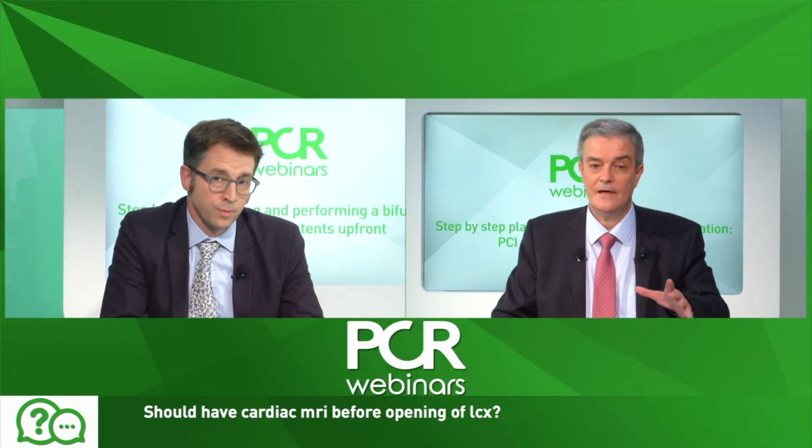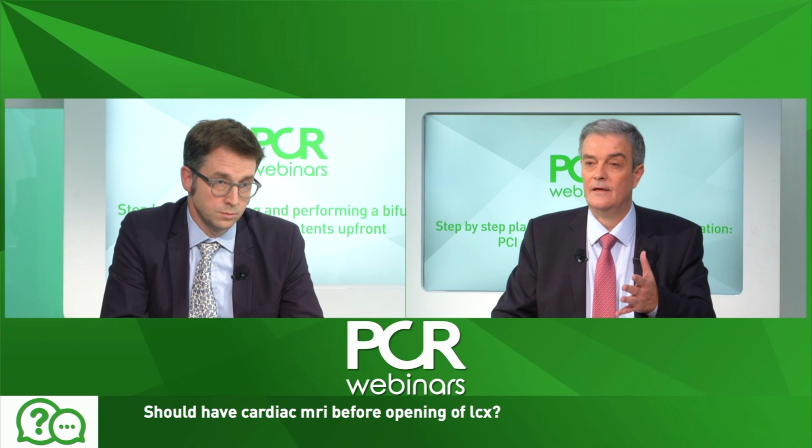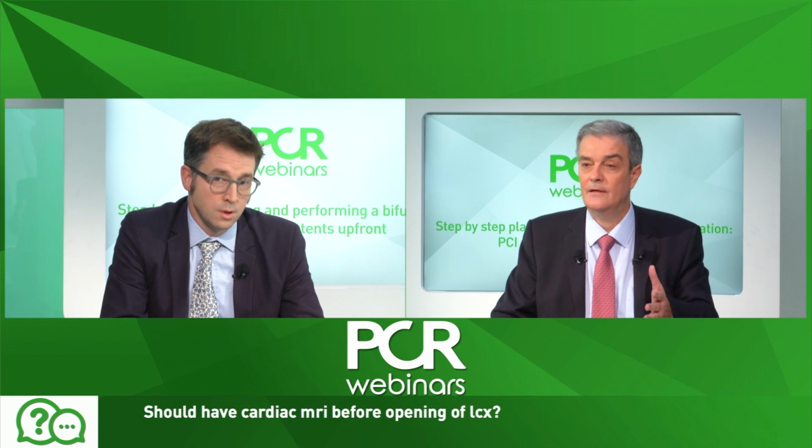So you decided to proceed after this IVUS. Have you changed the strategy? You remained with TAP? Or?